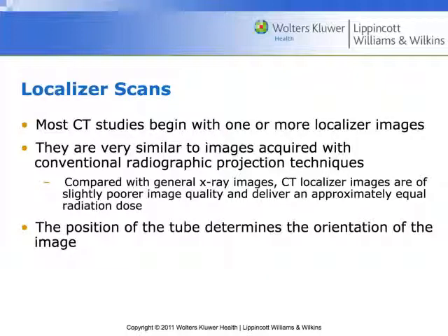what's the word for it? They call them scouts, but the principle behind it is, the philosophy behind this is a stereotactic approach to doing things. Stereotactic is just a fancy word for we're going to get an AP and we're going to get a lateral, and between those two views we are able to see 3 dimensions and we can plan accordingly, right? So between these two views, that's the word stereo, we can plan tactic, right?